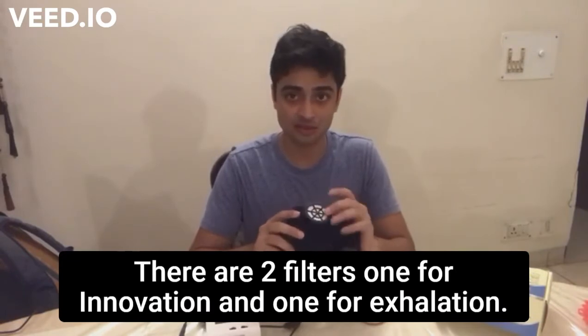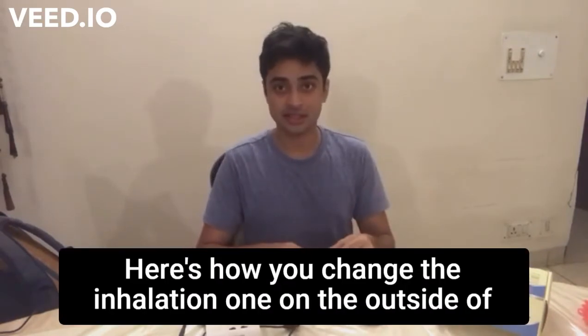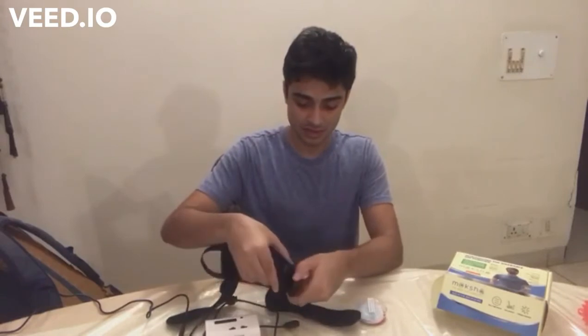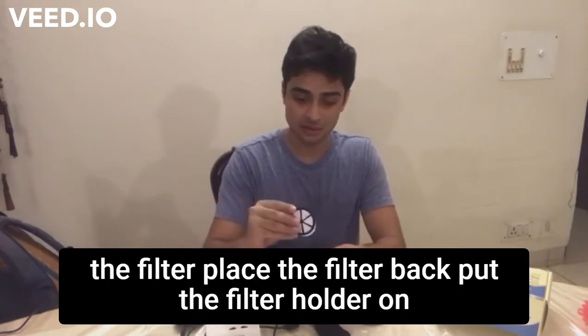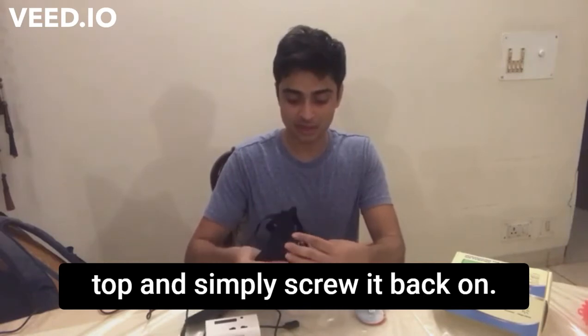There are two filters: one for inhalation and one for exhalation. Here's how you change the inhalation one. On the outside of the mask, unscrew the cap. You'll see that there is a filter and a filter holder. Replace the filter, place the filter back, put the filter holder on top, and simply screw it back on.